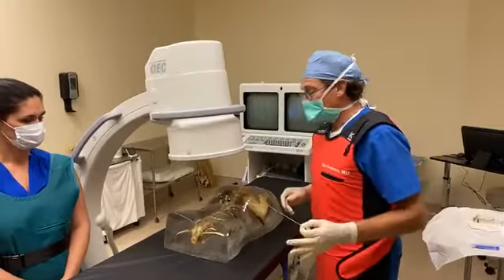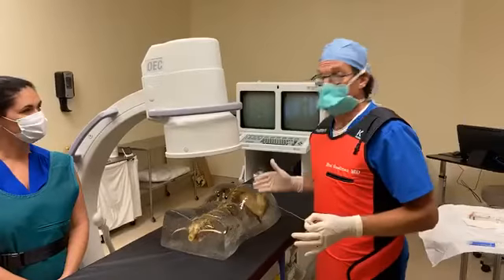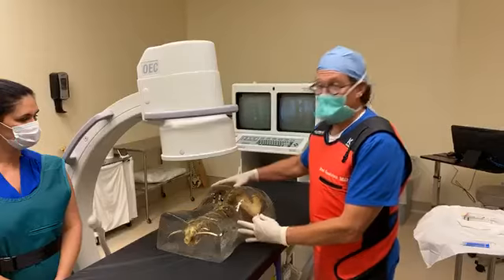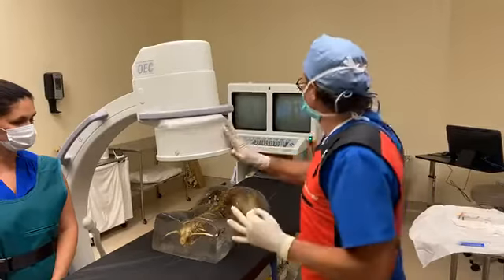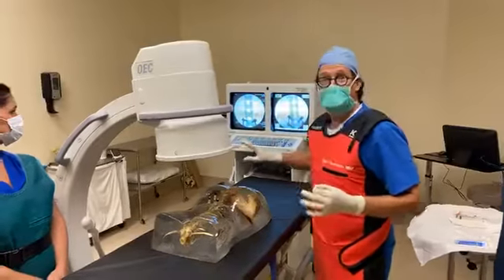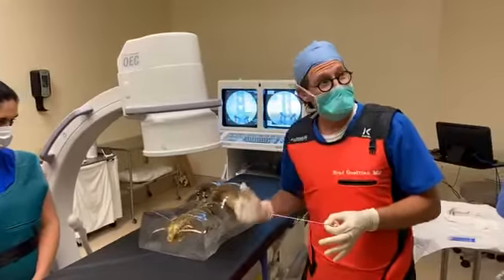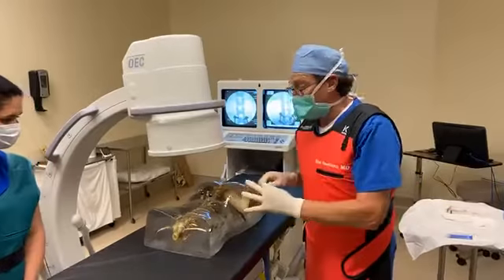And BioTras has been kind enough to let us use one of their models today that they basically encased in silicone. So now not only can we do the procedure under fluoro, but then we can look at what we're doing and see what we're doing on the model.